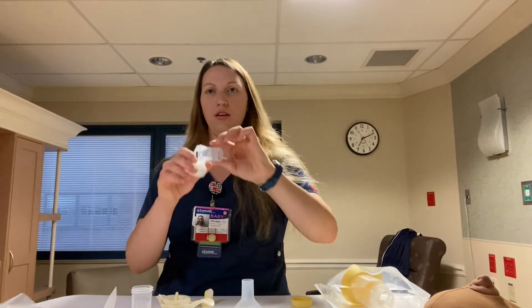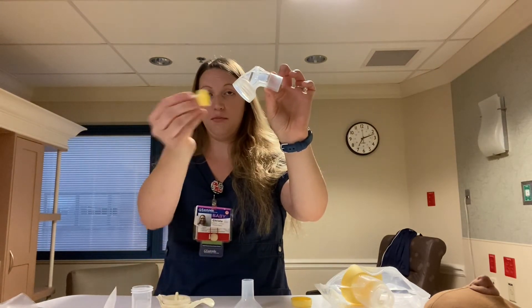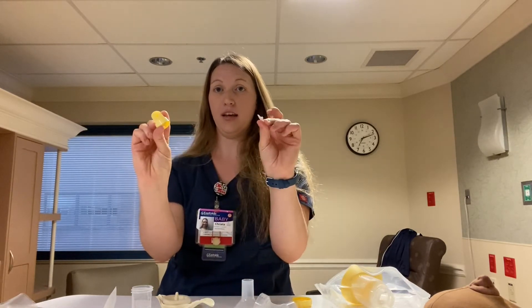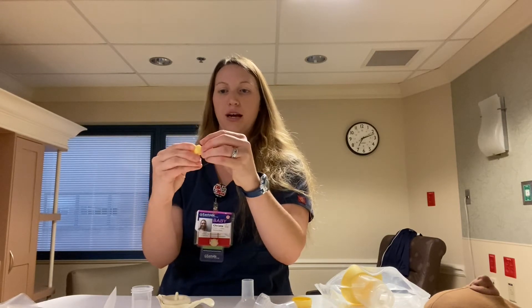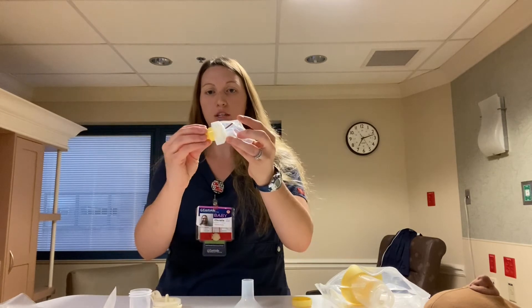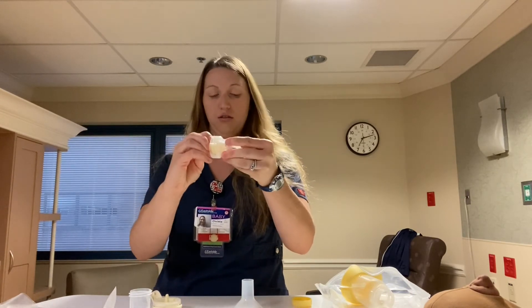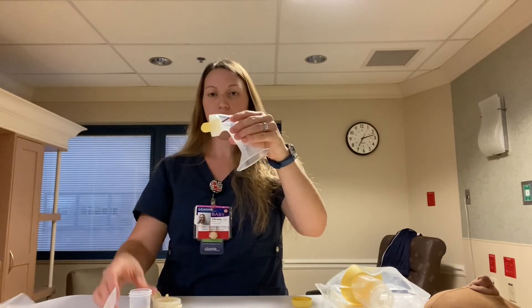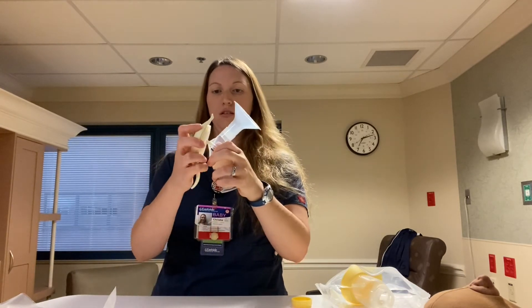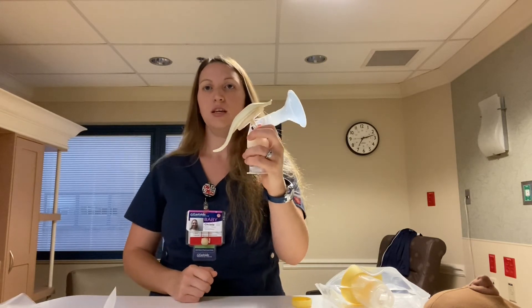I explain to the mom that after she uses the pump, there will be four parts that need to get washed. We have the flange, and then this piece that pops off — it's actually two pieces in one because it has that white membrane you can remove, but I always put it back on so we don't lose it. Whatever size bottle we use, this handle piece does not need to get washed — no fluid should come in contact with it. We pop this piece into place, put the flange in, screw the bottle in place, and pop that into place.